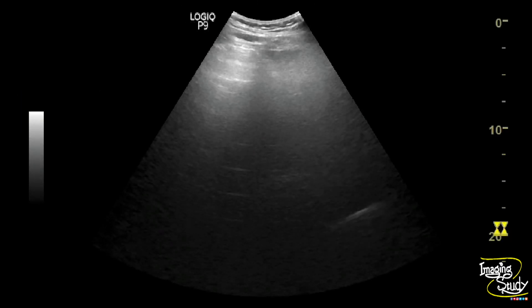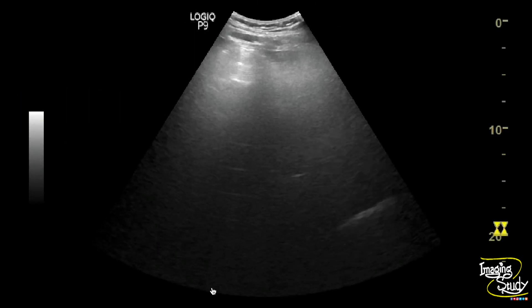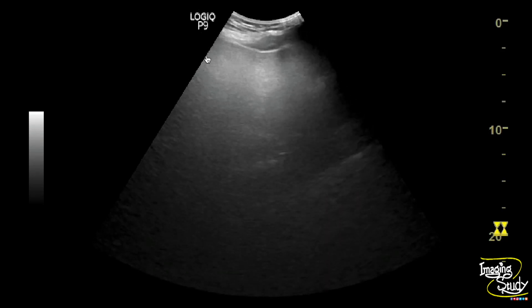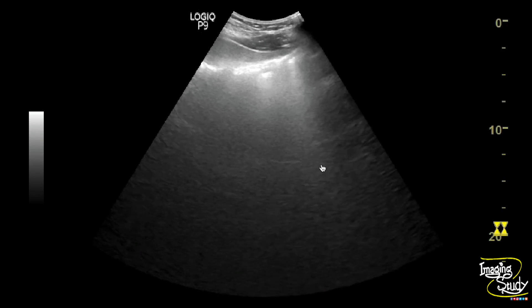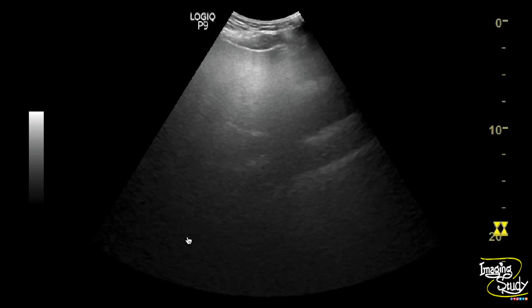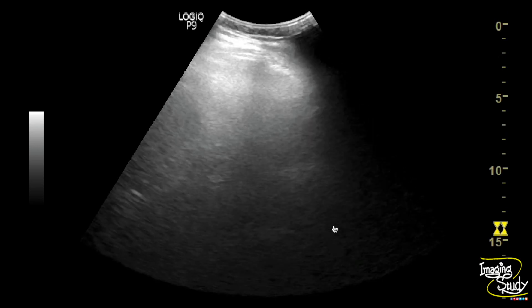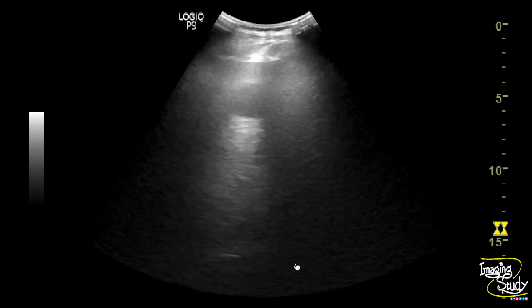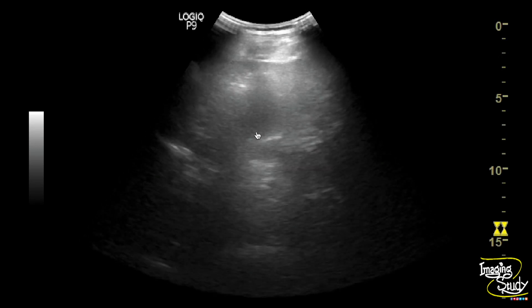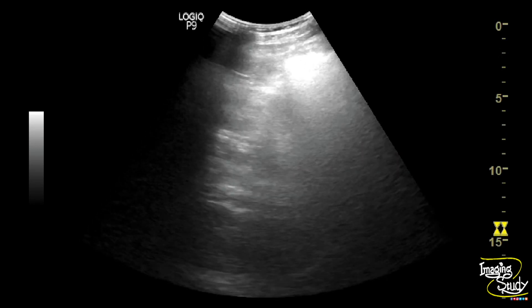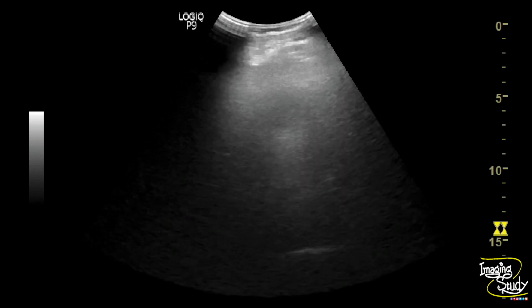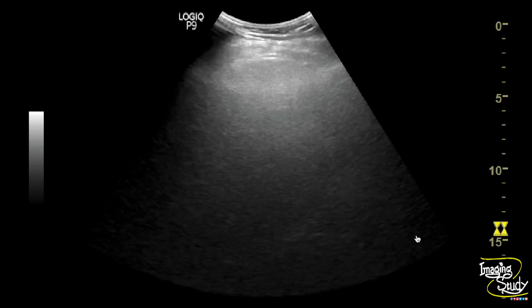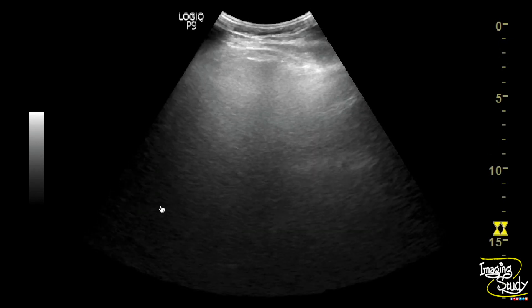You can see the right lobe of the liver — this is not the gut, this is the right lobe of the liver. You can see part of the gut, but overall the liver parenchyma echogenicity is grossly increased. You can see the gallbladder here, but you can't see the parenchyma and intrahepatic vessels well.